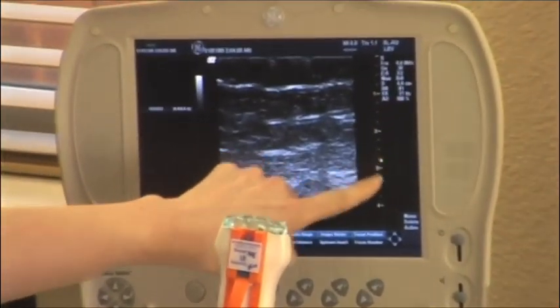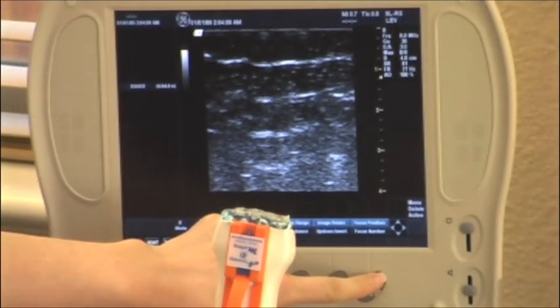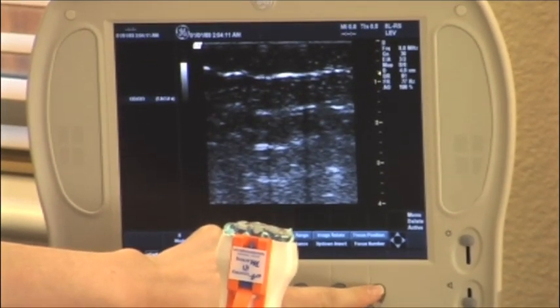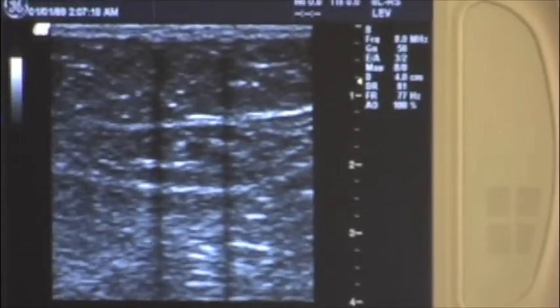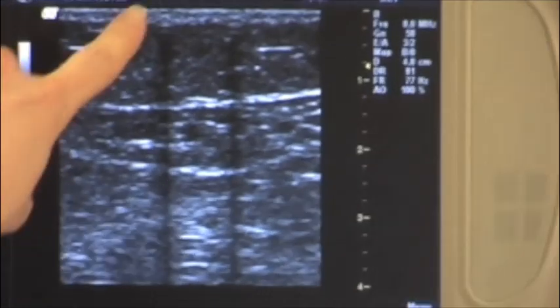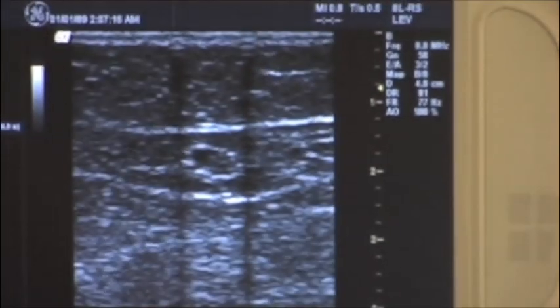After you have applied the AIM device and shadow guide accurately to the transducer, adjust one focal zone on your ultrasound system to the near field of your ultrasound image. Notice the delineation of the reference lines produced by the shadow guide once the focal zone is properly adjusted.